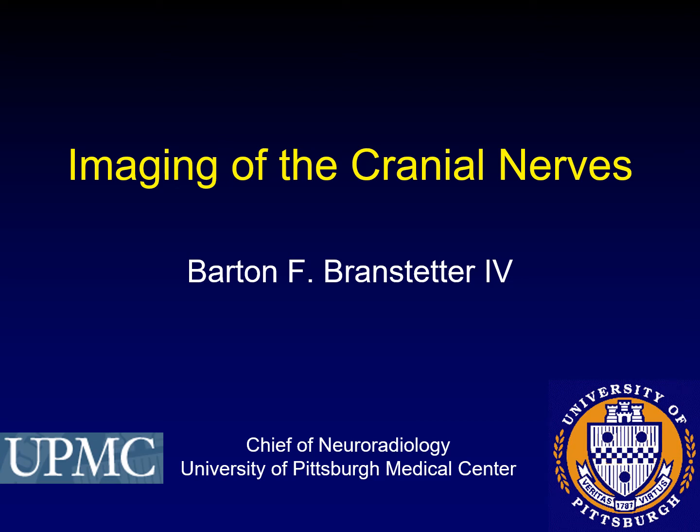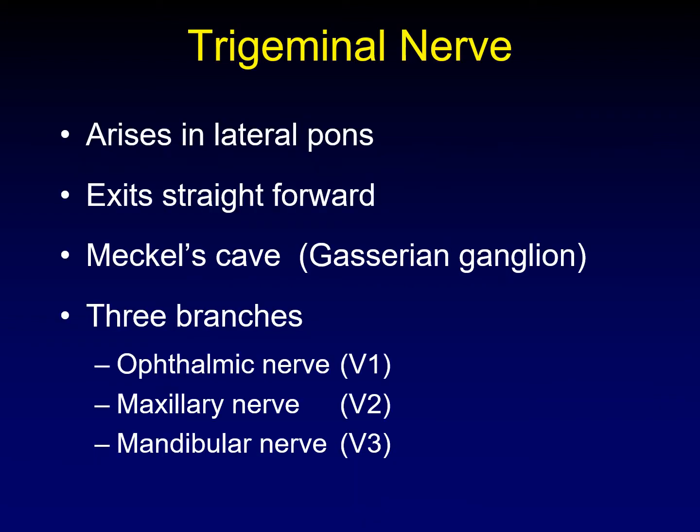This is the beginning of part 3 on the lecture Imaging of the Cranial Nerves. The fifth cranial nerve is very complicated, and we're going to spend a lot more time on 5 and 7 than we do on the other cranial nerves.